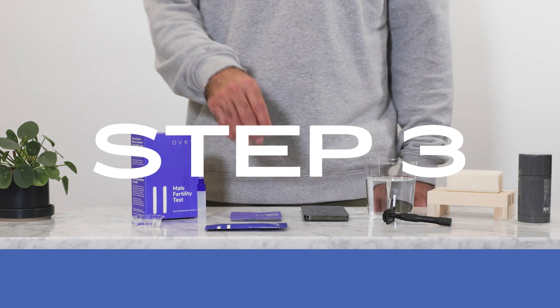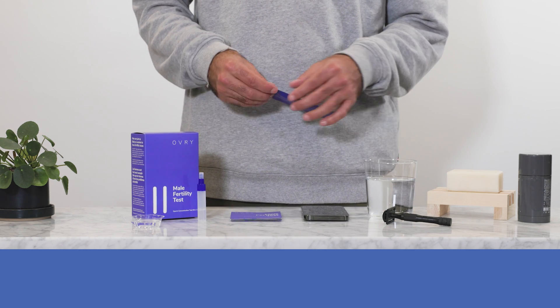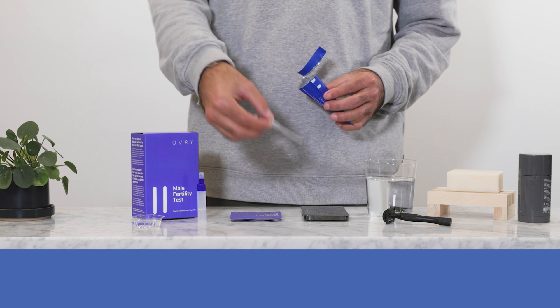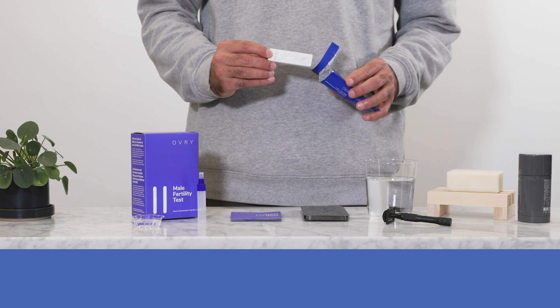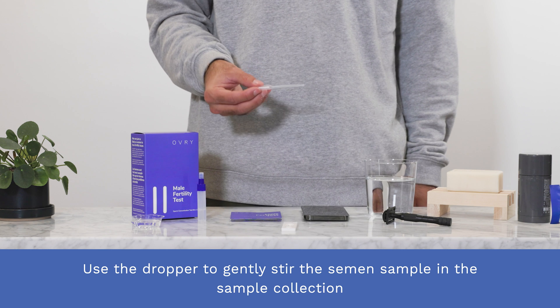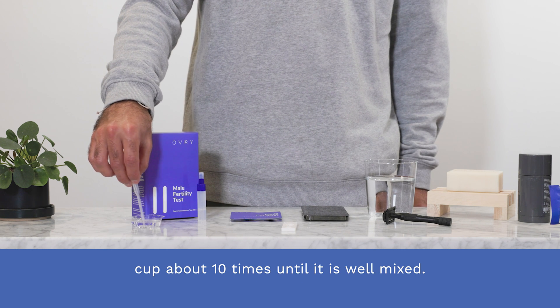Step three. After an hour, open the test pouch and remove the dropper. Use the dropper to gently stir the semen sample in the sample collection cup about ten times until it is well mixed.